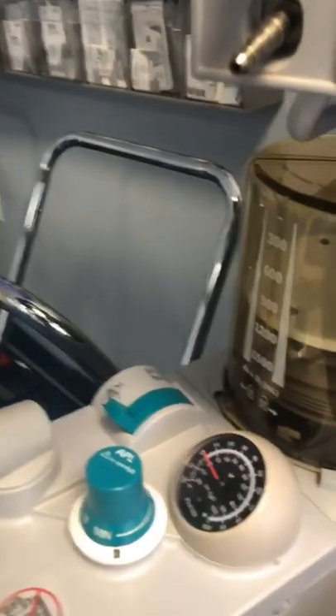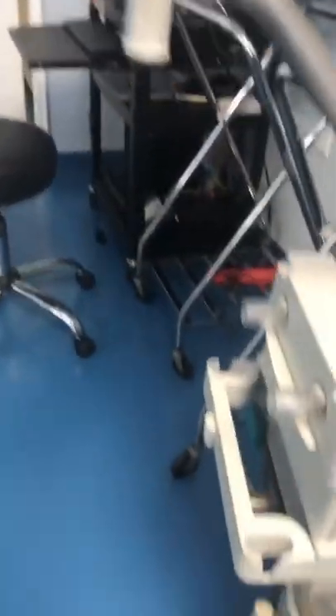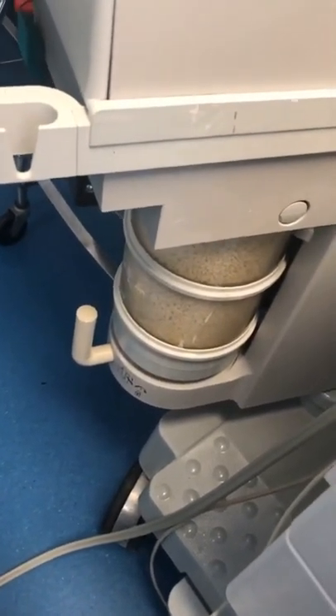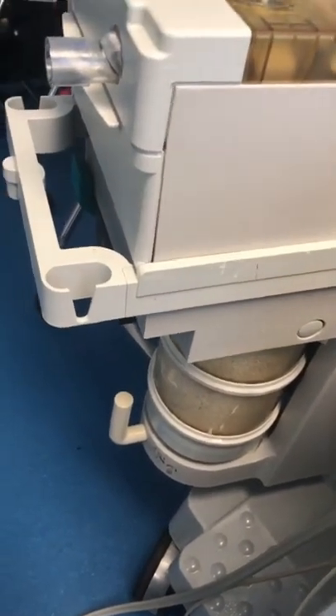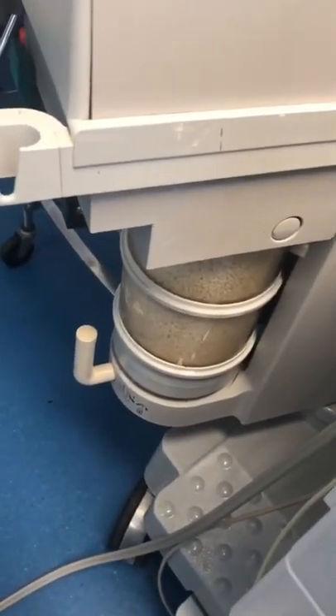Then I come over to my ventilator — again, this is just the way I do it. I take a look at it. My absorbent is nice and white, so I don't need to change that. If it's purple, you may have to consider what your actions will be — if it's purple, it's either exhausted or almost exhausted, and you may have to change it.